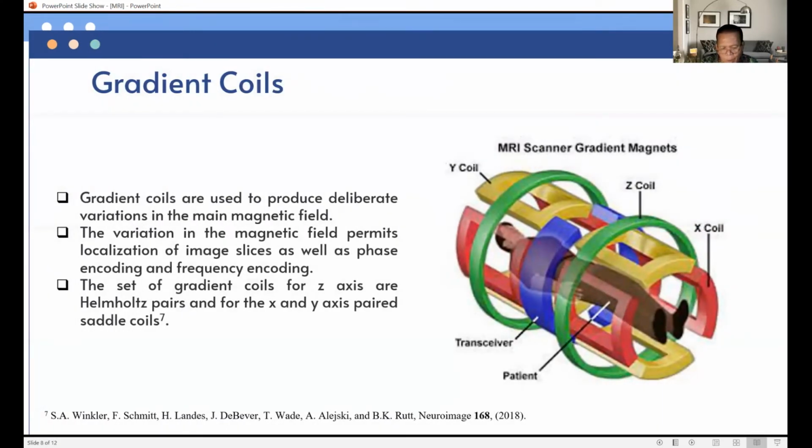Resistive or air core MRI magnets operate at room temperature using a standard conductor such as copper in the shape of a solenoid or a Helmholtz pair coil. A solenoid is a cylindrical shaped coil of wire. The uniform magnetic field is found inside the coil, especially in the center.